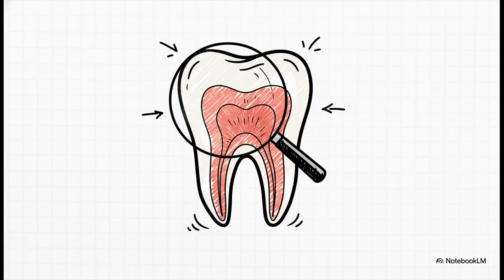And that's the thing, right? To truly understand what's going on, we've got to look deeper. And that's where diagnostic imaging comes in. It's basically our superpower. Radiographs are our eyes inside the tooth, inside the bone. They show us things we could never see otherwise, and that makes them absolutely essential for getting the diagnosis right and coming up with a treatment plan that's actually going to work.